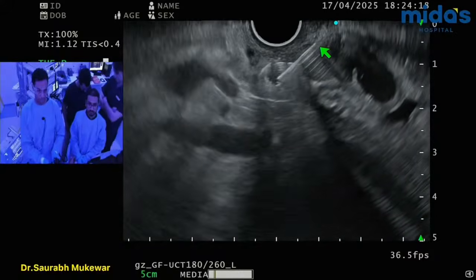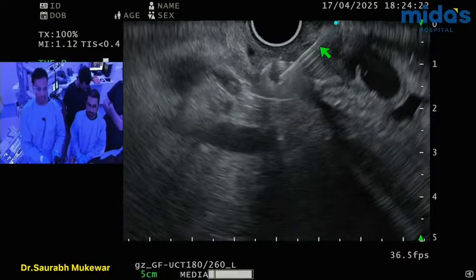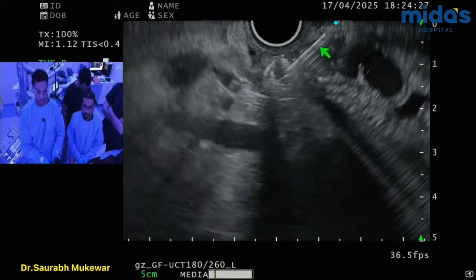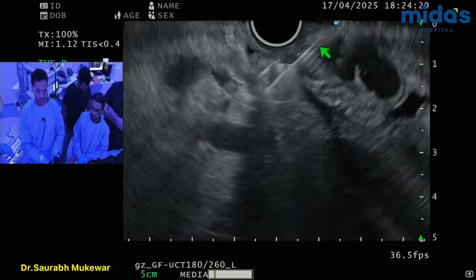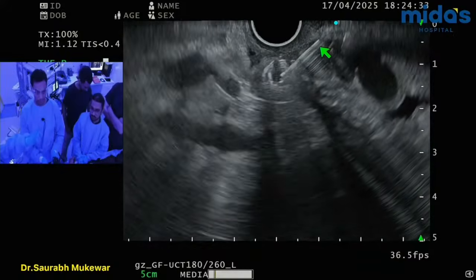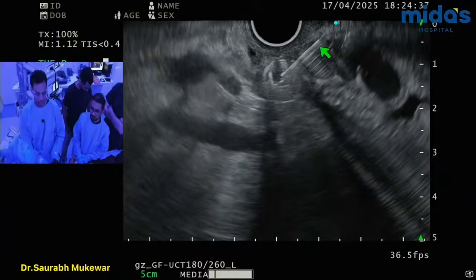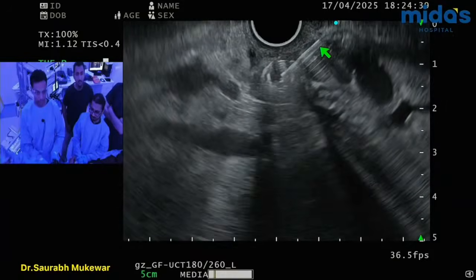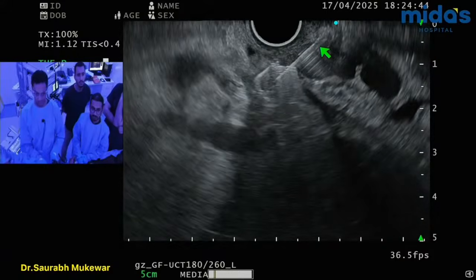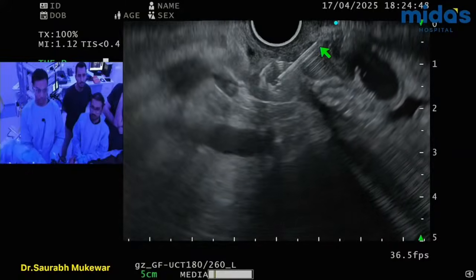Hey, did you deploy it completely? Yes. I wanted to. I feel like it's something. Okay, no, it's okay. It's fine. Yeah, no, it's not. You'll have to push again. Push all the way. No rush. Push, push, push. Yes. Now done. See the difference? Good.